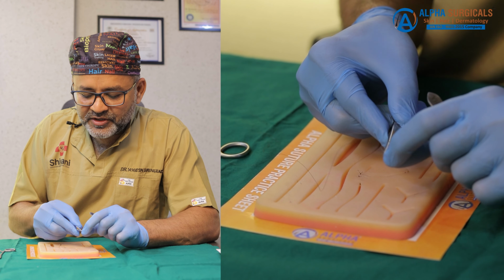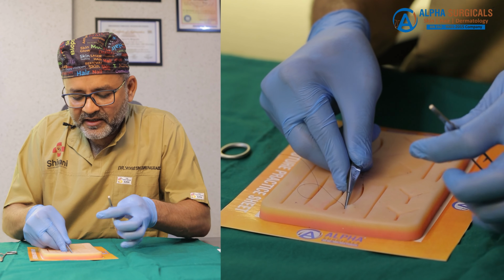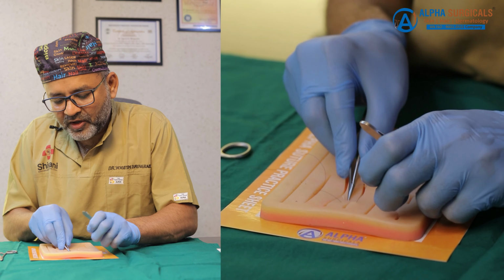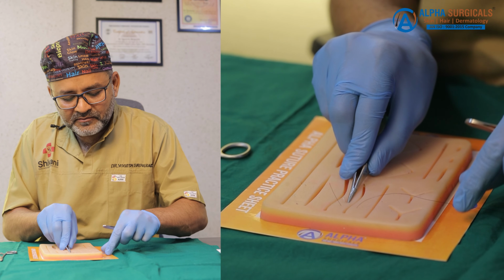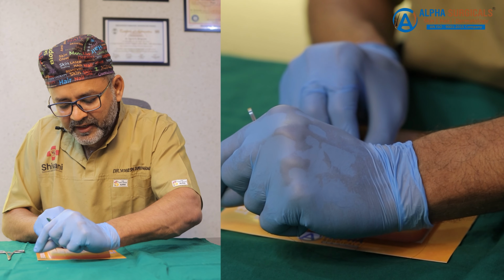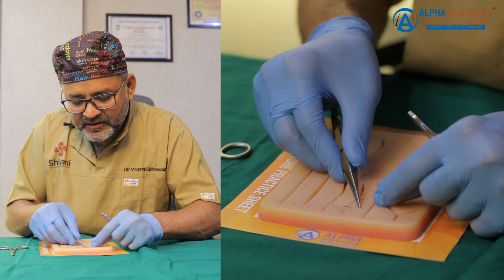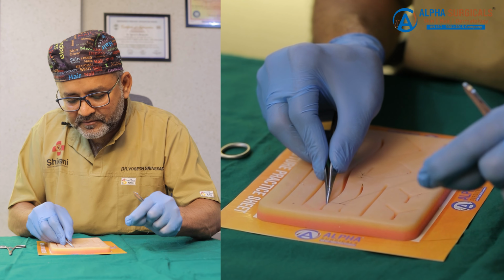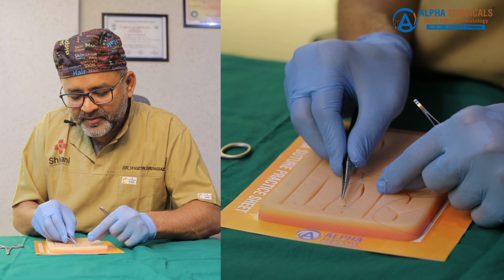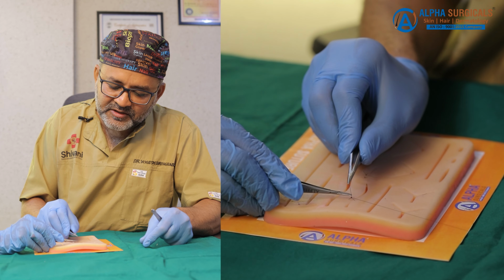The first suture will resemble that of a simple interrupted suture. Entering from one side, exiting from the other side, taking the needle out and giving the knot. 1, 2, 3. Three loops are given, holding the thread and giving the closure. Rotation of the thread to fix the knot here, and then a second knot, third and fourth, and then we will cut the thread 2 to 3 millimeters from the surface.